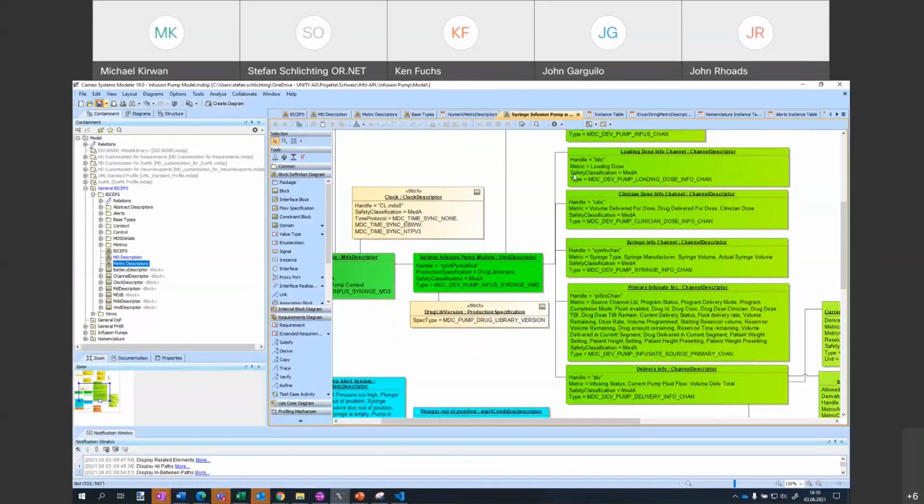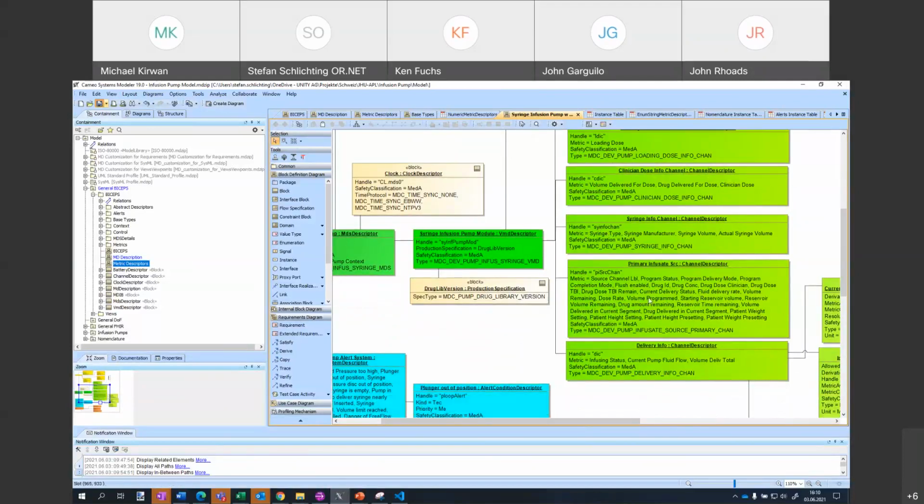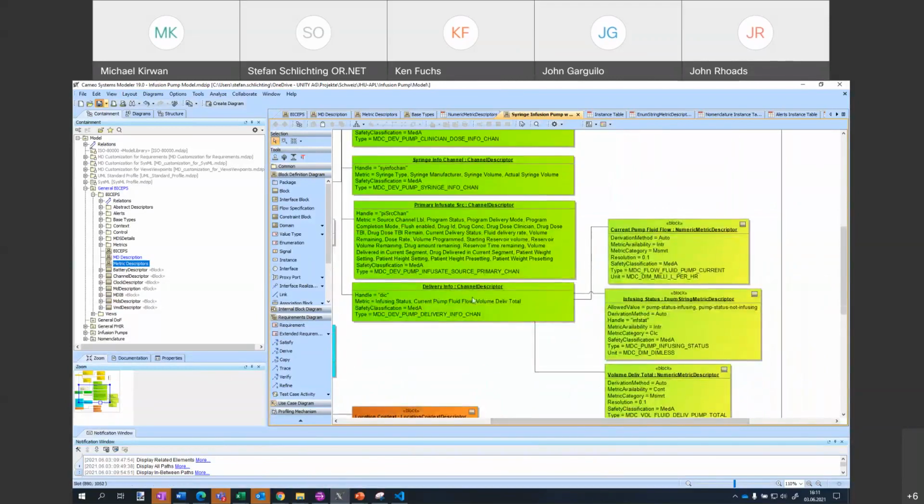As you can see here, which is not highlighted in the diagram, they also have different kinds of metrics included. They, of course, all have a type, as from the 11073 nomenclature. If you look into some of the details, for example in delivery info, there is something like the current pump fluid flow, which is modeled as a numeric metric descriptor. It's probably some kind of measurement, and probably continuous rather than intermittent. It has a type and a certain unit, so very similar to what you would expect.